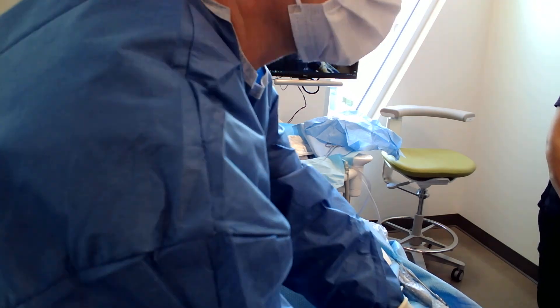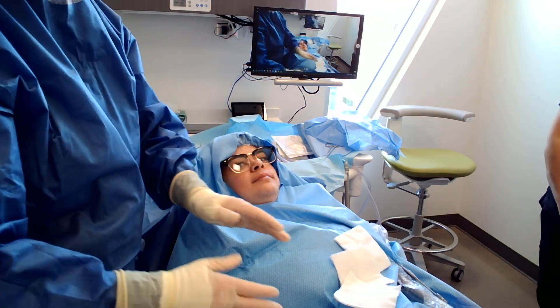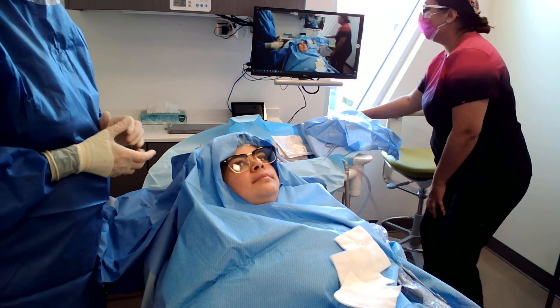Does anyone have any questions? This is why we call it Christmas dinner — it took me a long time to set it up, the surgeon comes in for 10 to 15 minutes, and then it takes me a lot longer to clean it all up again. I always have garbage tucked away and make sure the operatory looks as clean as possible. Thanks everyone — that was cool.